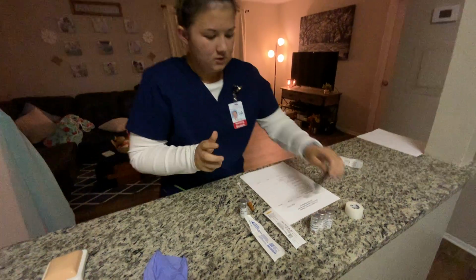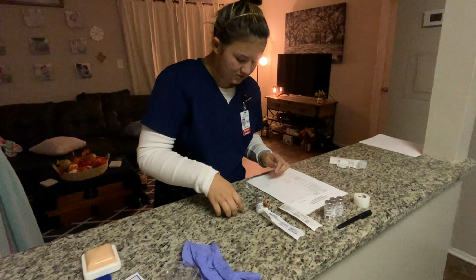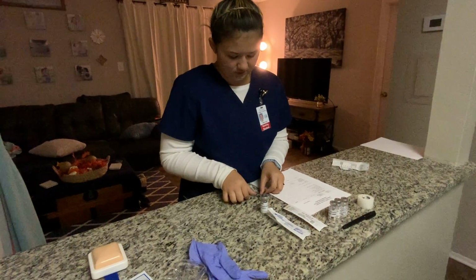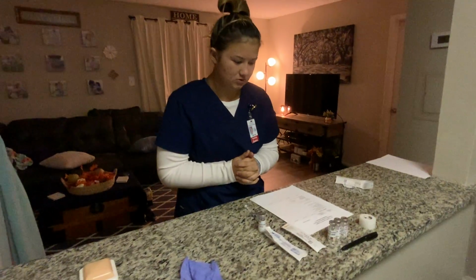Okay. So now that my label is prepared, I'm going to put it towards the bottom of my syringe where it doesn't cover how much is in my syringe, where I can keep a good amount, or to make sure I have the correct amount in my syringe.